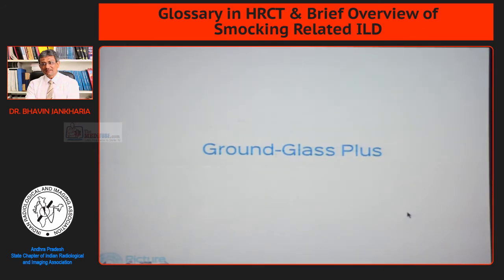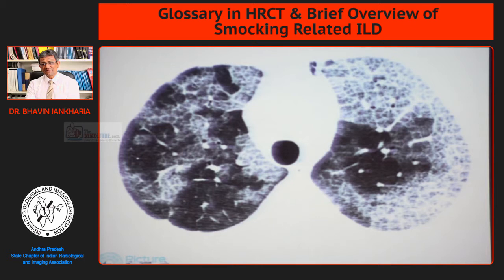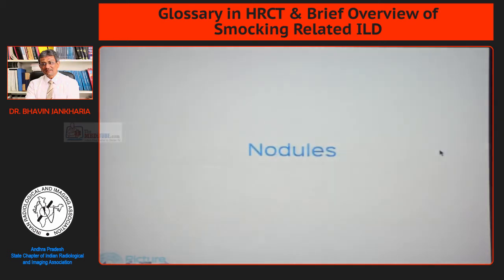You can have ground glass with other things, which we call 'ground glass plus.' Ground glass plus is ground glass combined with other findings. Here we have ground glass — increased lung attenuation that does not obscure the vessels — along with septal thickening. You have interlobular septae that are thickened. Septal thickening with ground glass is an entity we also call the crazy paving pattern, and this is seen in alveolar proteinosis.